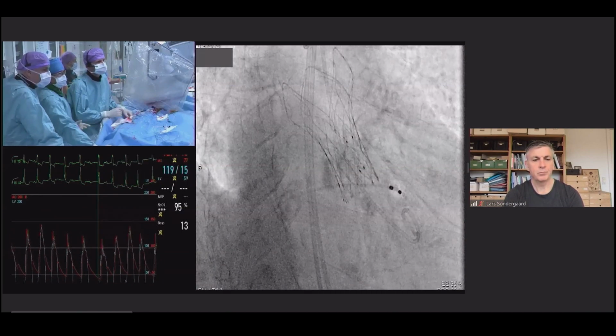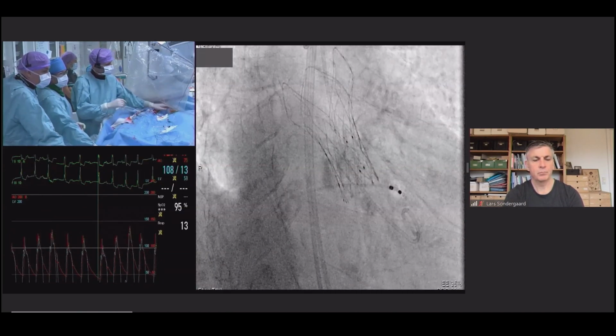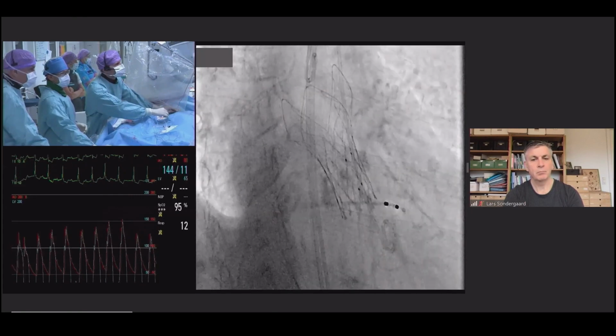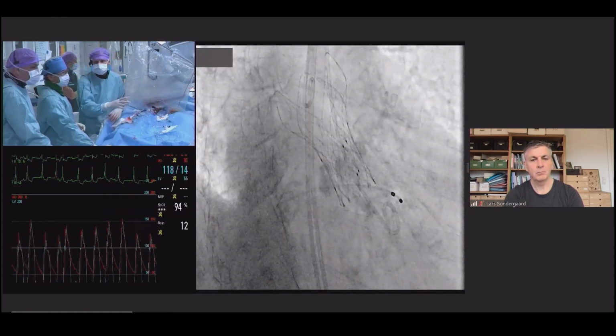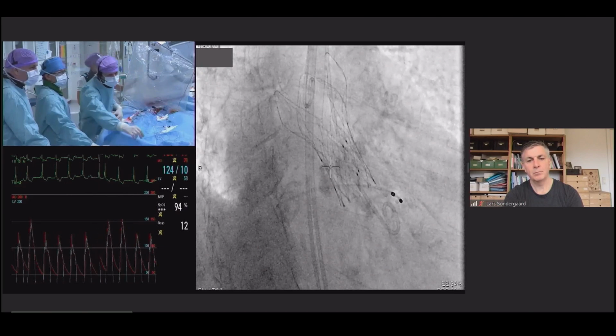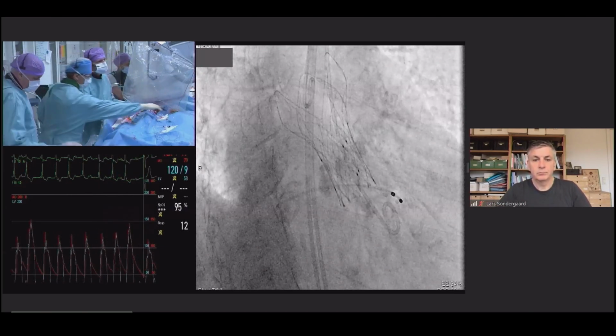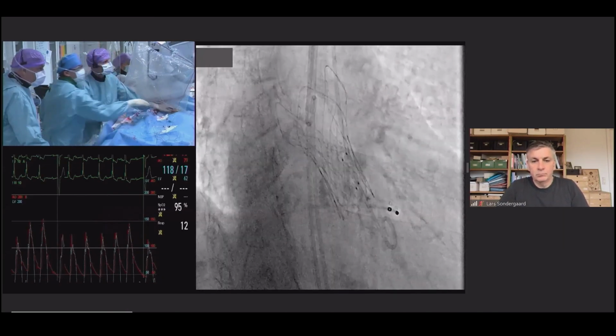We had 42 before in the aorta. We got 50 now. That's better. We got 24 in the LV. We got 23. So this certainly does not indicate any significant gradient, rather small anatomy, no gradient. I think it's also important here that we don't have a gradient. We have a reverse gradient. So we'll record this, and we can do an aortic root injection.